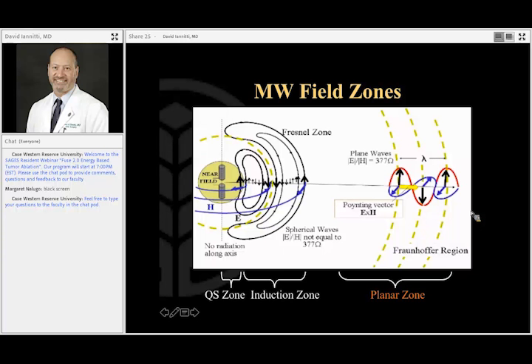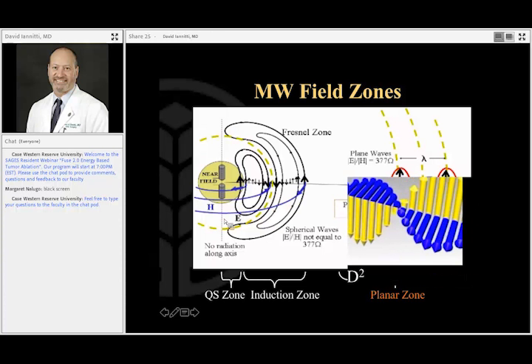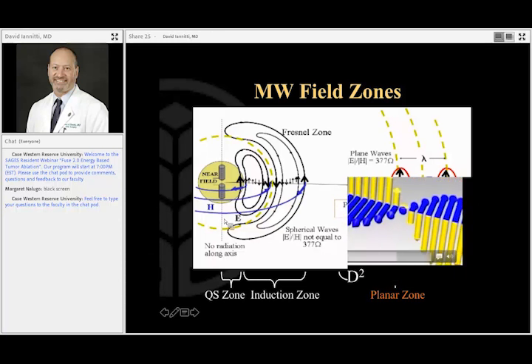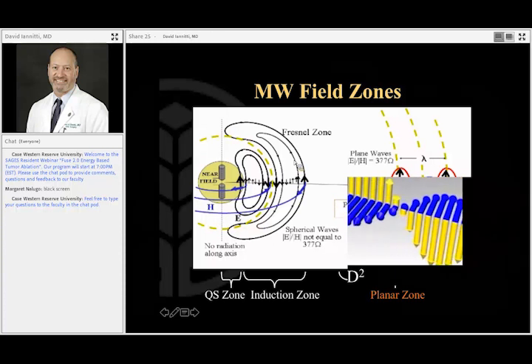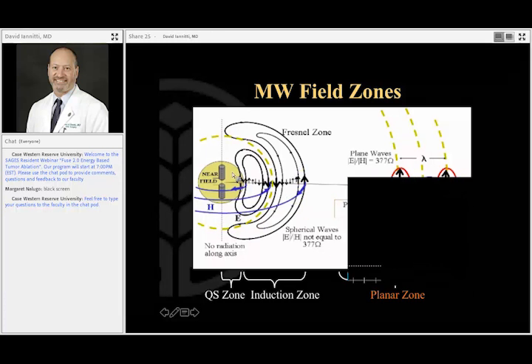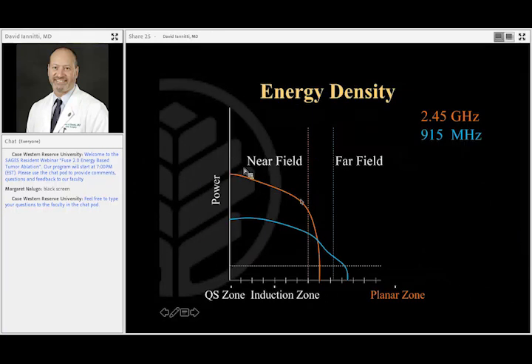And that's why you have a tight microwave field. And this is a planar wave here. You have an electrical field and a magnetic field that are perpendicular to each other. And again, that energy falls off fast. And that's why for these frequencies, 2.45 gigahertz, you see even energy distribution for a certain period, about 2 centimeters, and then that energy falls off because this is the transition point where you transfer from spherical waves to planar waves. So that makes all the sense in the world.